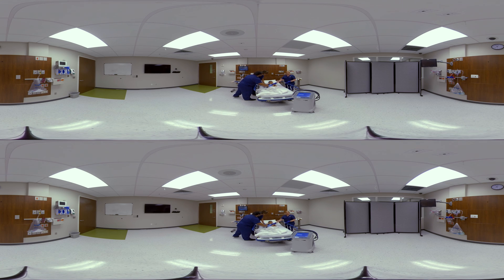The pads can be adjusted, removed, and replaced for up to five days of therapy. Next, George is going to do the thigh pad. When placing the thigh pad, you want to make sure that the hoses are always anterior to the patient, always pointing towards the patient's feet. We'll have that hose on the front of his thigh and then it will wrap around. If the pads are too big, they will simply overlap on top of each other. You want to make sure that you never cut the pads.